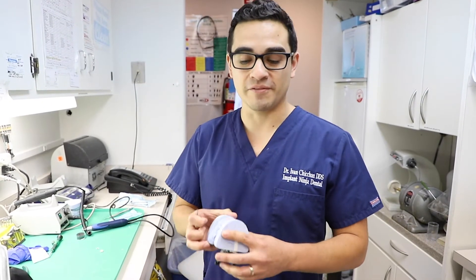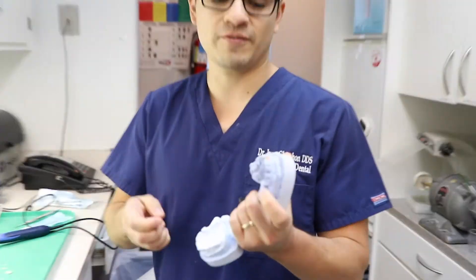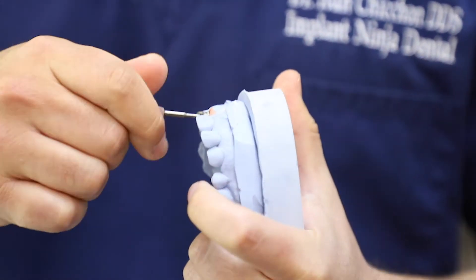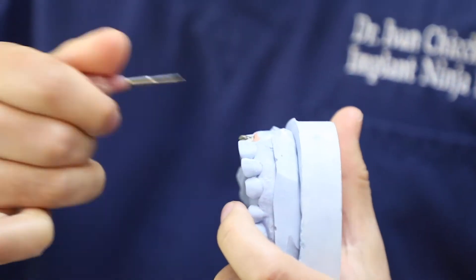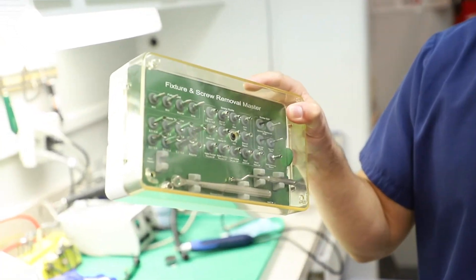I was just getting ready to make a video on how to deliver an implant crown and of course the inevitable happened. This guy got stuck. My screw is stripped and I can't retrieve it. So I figure it's the best time to show you guys how to use a screw removal kit.